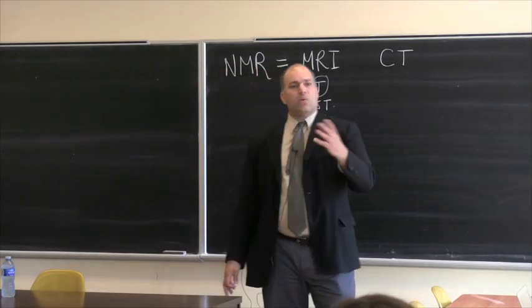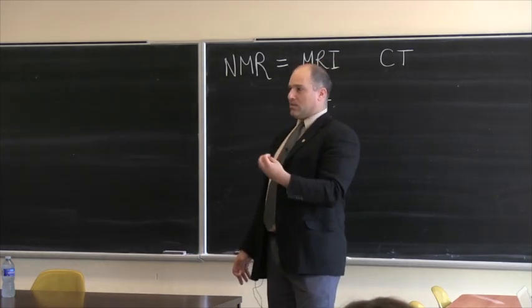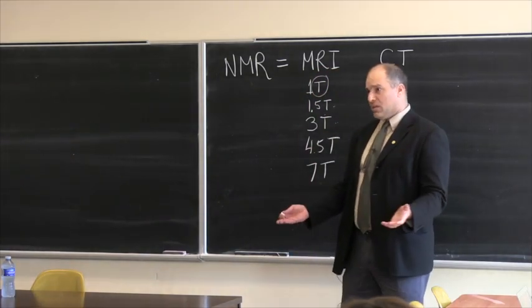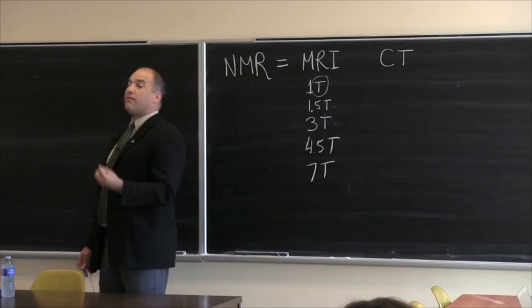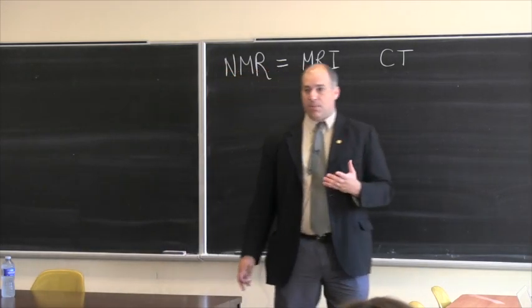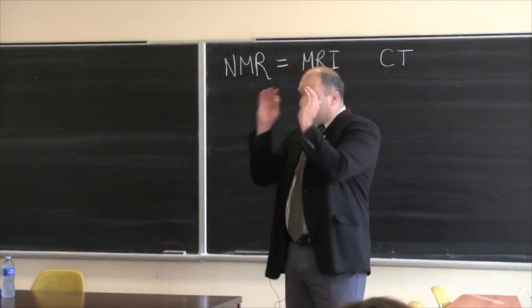Now, I don't know when was the last time you were stone still for an hour and a half, but the early scans that I performed required people to lie still for an hour and a half. Today, still, we have scans that require people to lie down and hold still, if not for an hour and a half, for an hour or close to an hour. That's a very unnatural situation for a lot of people, particularly for people who are claustrophobic. And then you put them into a tunnel that is very, very tight.